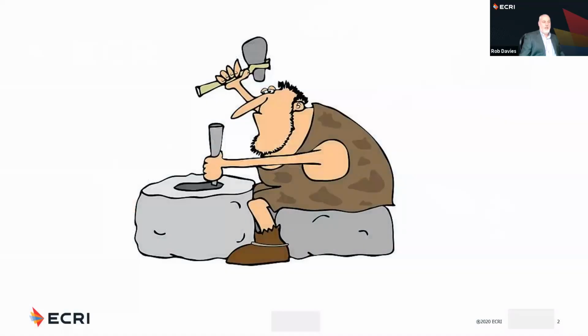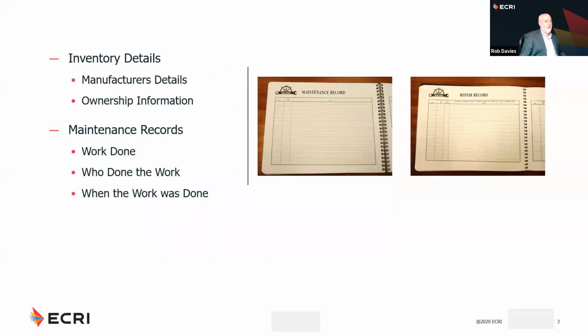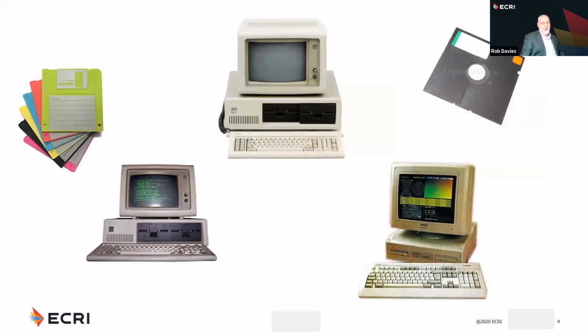We're going to have a quick look through the existing equipment management system and how it's evolved over the years. We're not going to go back quite this far, but some of you may remember, and there's potentially still some that are still doing paper records, filling up lots of cabinets around the department with very simple basic equipment details, and handwritten job requests. During the 80s, personal computers became cheaper and more readily available. So people started transferring to computer-based systems, and that was really the start of the equipment management system as we know it nowadays.